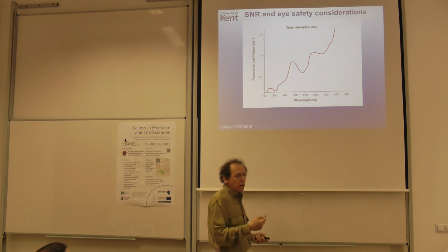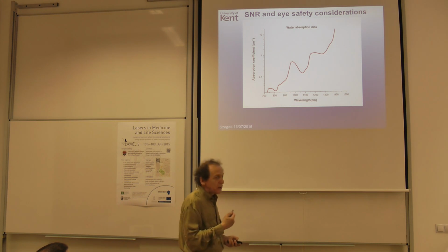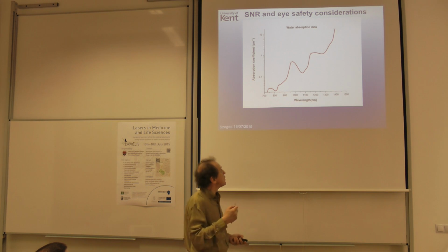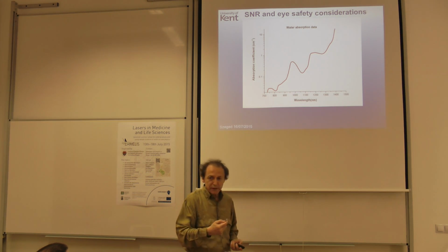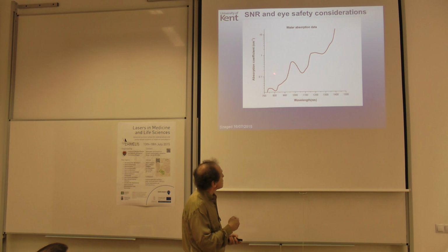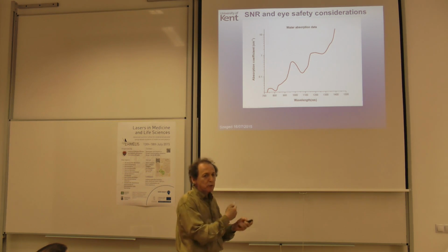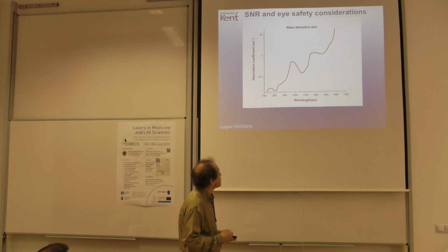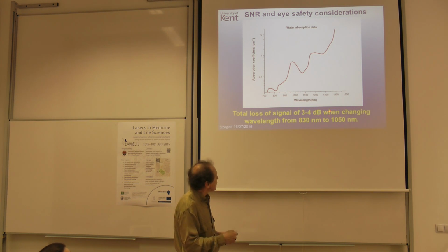However, we know that the longer the wavelengths, the less the scattering, so we may get better penetration. And indeed, those doing ophthalmology are very much interested in seeing deeper and deeper, especially in layers in the retina called the choroid. To penetrate there, we need more penetration, and the only way is by going to longer wavelengths. But if you go to longer wavelengths, the eyeball is 2 centimeters, it's water, 2 centimeters one way, 2 centimeters the other way, you have to encounter 4 centimeters of water. Because of that, nature gave us only this chance to work in this deep water absorption window, which is about 1060 nanometers. So it's here where the loss is acceptable in comparison with the conventional wavelengths.